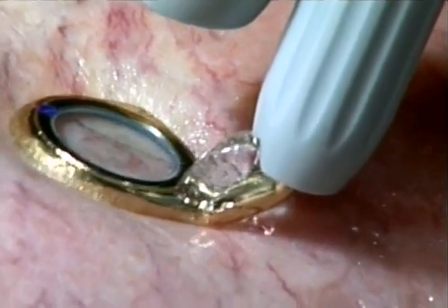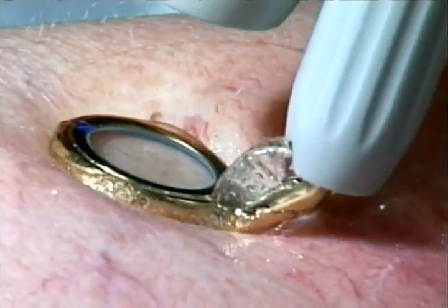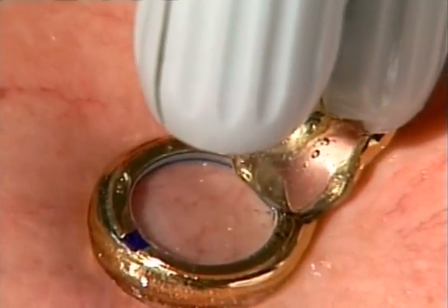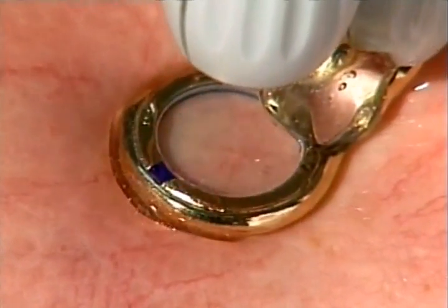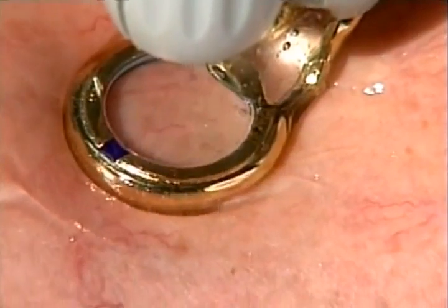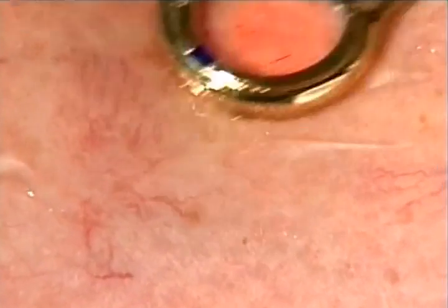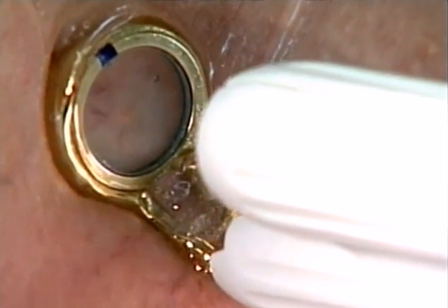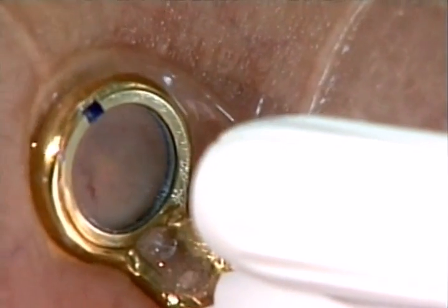That's a little larger vessel that we're targeting. And it's so hard to change hand pieces. Now it's just a breeze. Okay. And there's a couple real small ones.